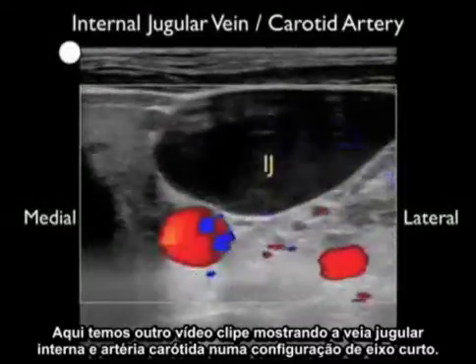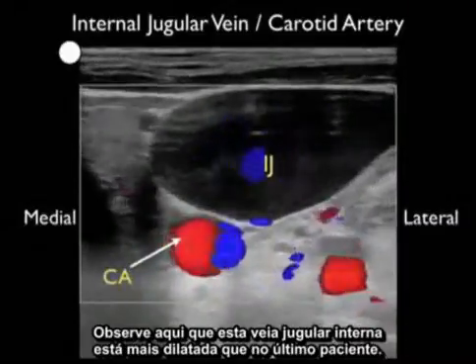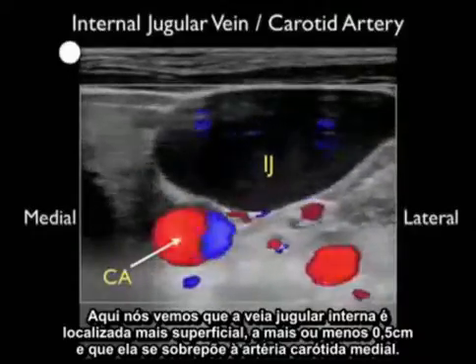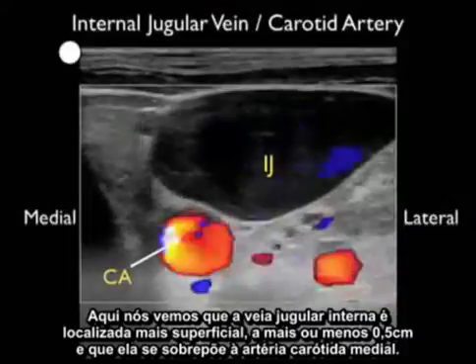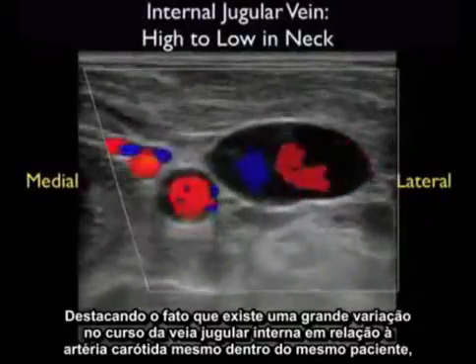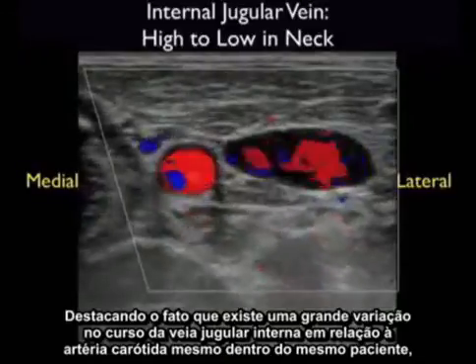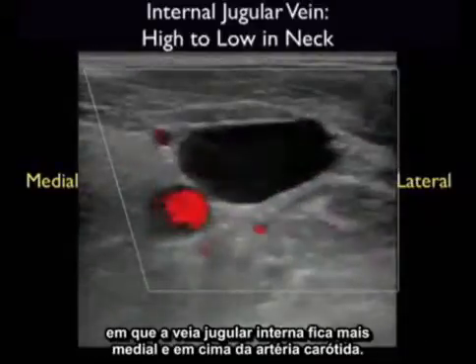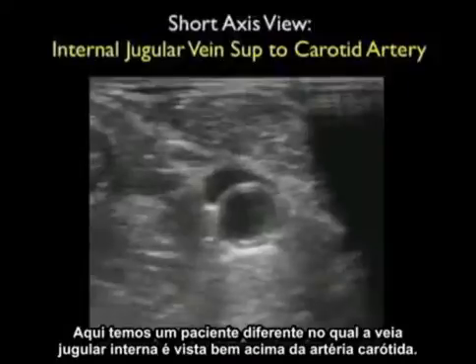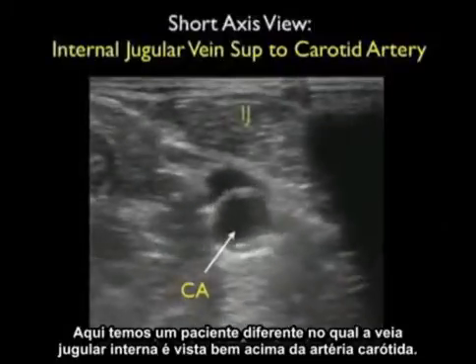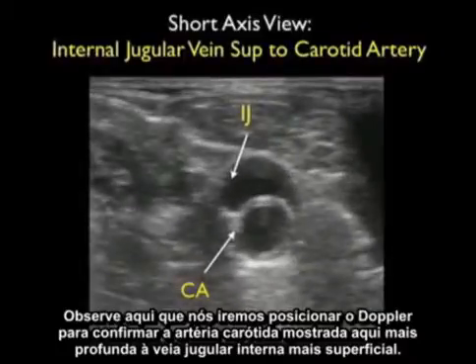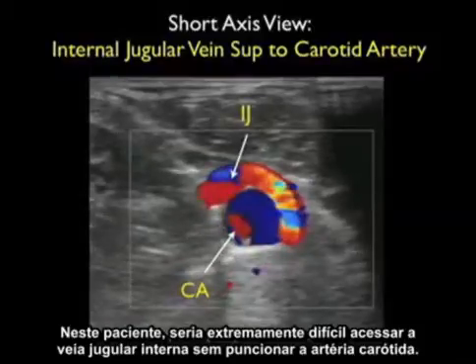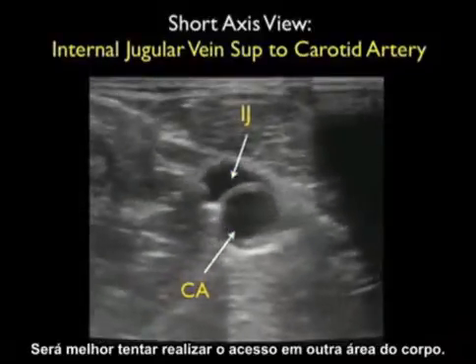Here's another video clip showing the internal jugular vein and carotid artery in a short axis configuration. Notice this internal jugular vein is much more distended than in the last patient. The internal jugular vein is located more superficially at about 0.5 centimeters and overlaps the carotid artery medially. This highlights the great variability in the course of the internal jugular vein — running the probe from high within the neck, where the IJ is more lateral, to a more inferior position, where it comes to rest on top of the carotid artery. In this patient, it would be extremely difficult to cannulate the internal jugular vein without puncturing the carotid artery, so it's best to attempt cannulation in another area of the body.